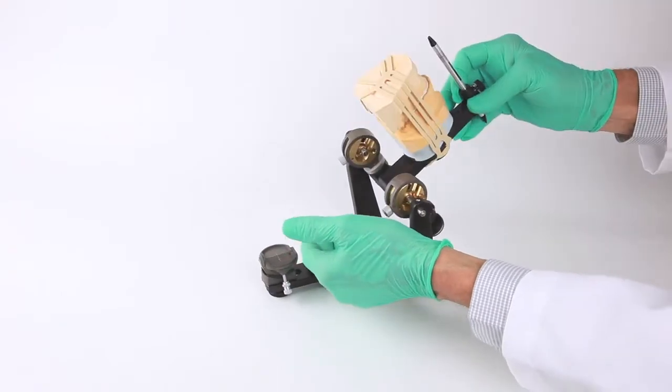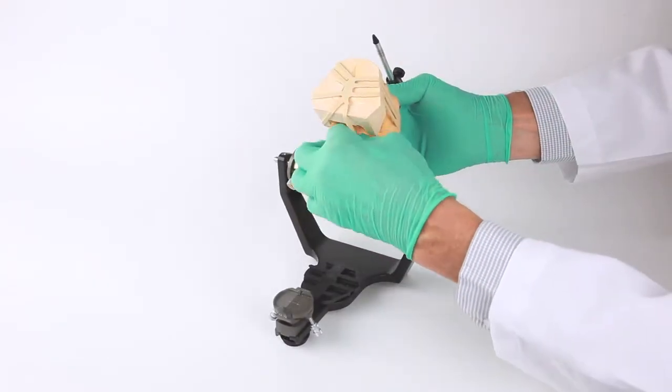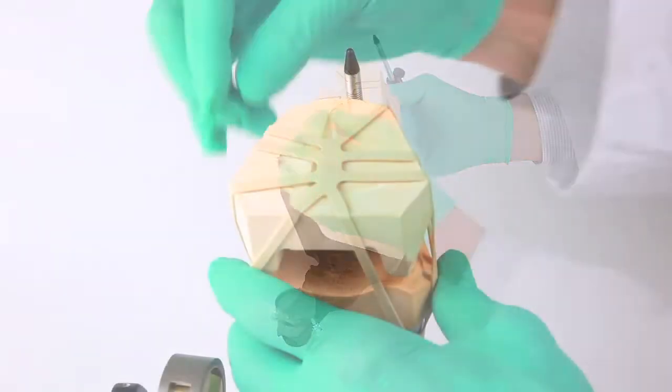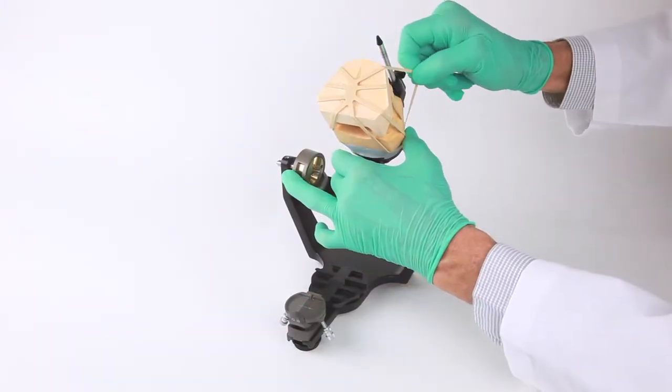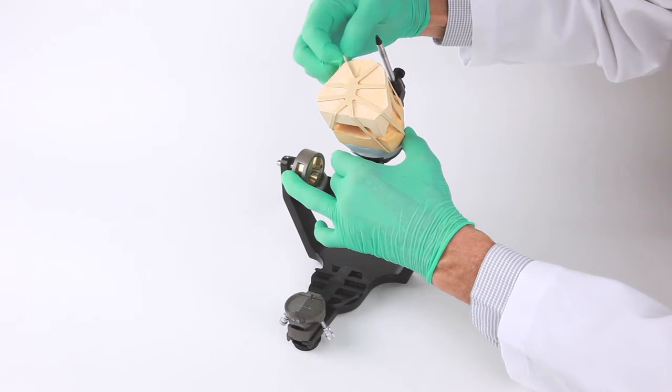Next, the articulator arm can be inverted, exposing the base of the cast, then the flexi-mount is centered on the cast by adjusting and positioning each of the separate elastic arms into position.